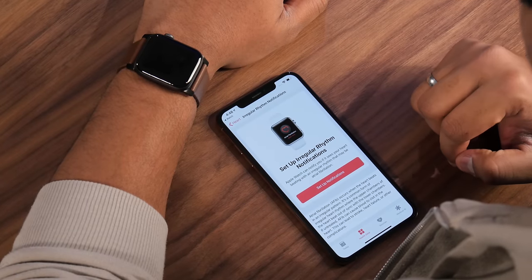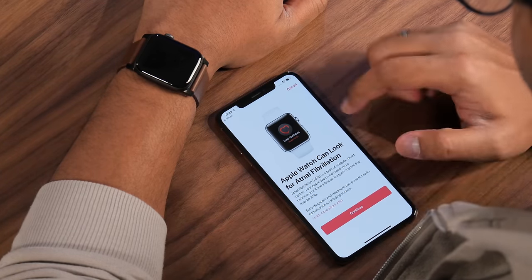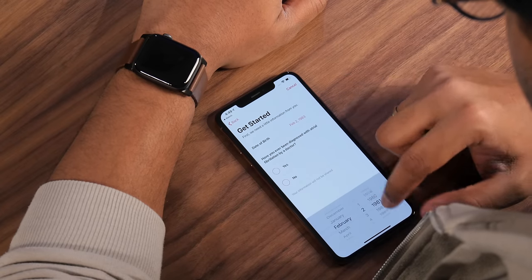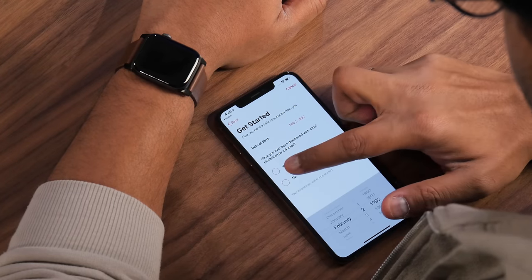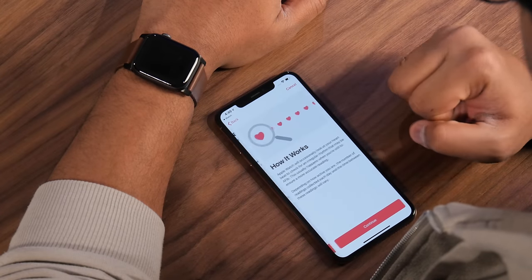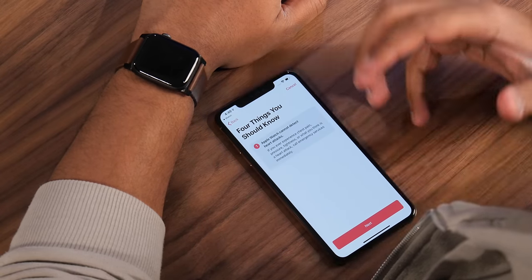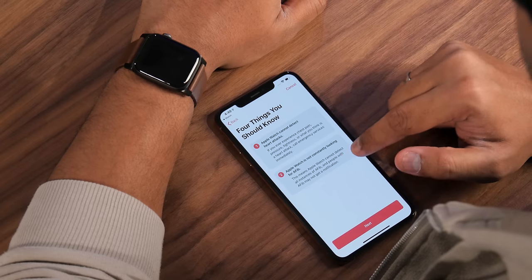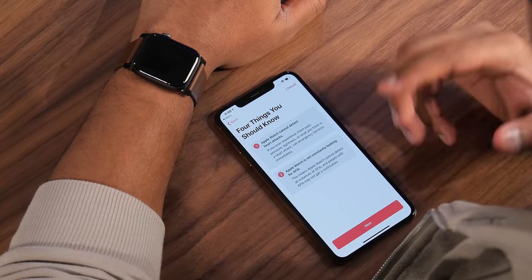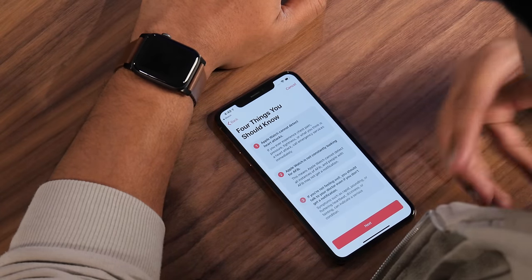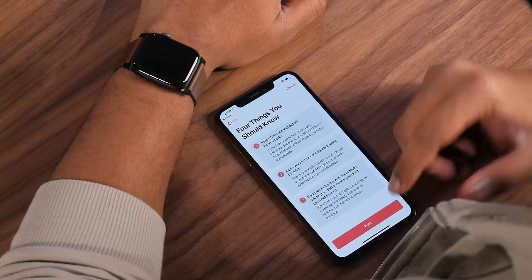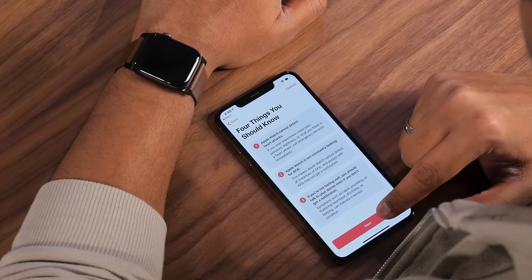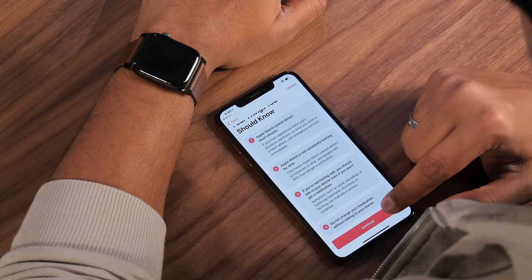Tap Setup, which takes you back into the Health app. Tap Setup Notifications, then Continue. Add your date of birth again, and indicate whether you've ever been diagnosed with atrial fibrillation by a doctor. There are four things to know: Apple Watch cannot detect heart attacks; Apple Watch is not constantly looking for AFib and may not catch all instances; people with AFib may not get a notification; and do not change your medication without talking to your doctor. If you're not feeling well, talk to your doctor even if you don't get a notification — symptoms like rapid pounding, fluttering heartbeat, dizziness, or fainting can indicate a serious condition.